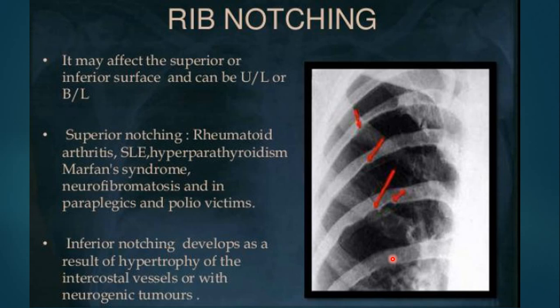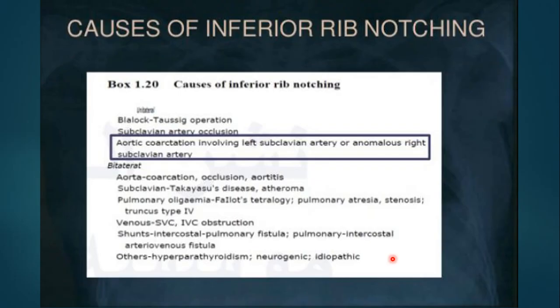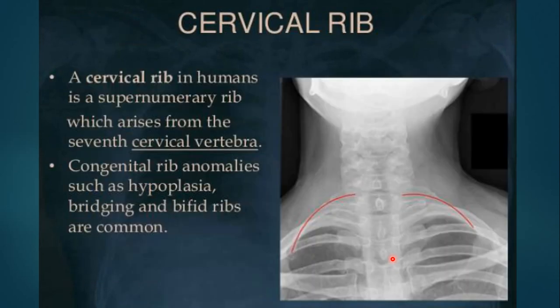Oh, a lot of you are writing. Several people are typing. Let's wait for the answers. Pre or post? Okay, I will not give you the answer of that till I have some answers. Preductal or postductal? We'll go back to this slide later.